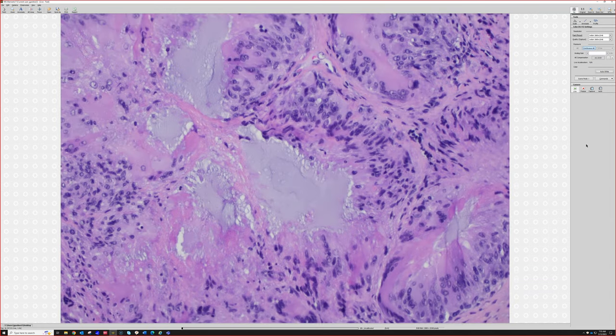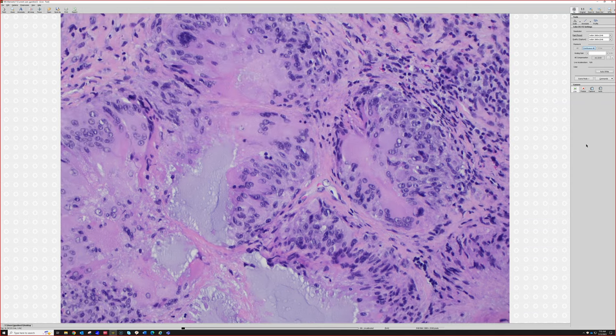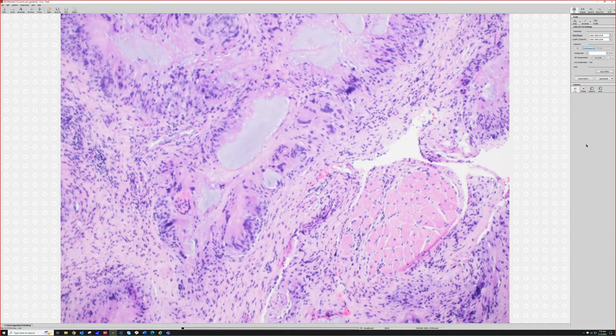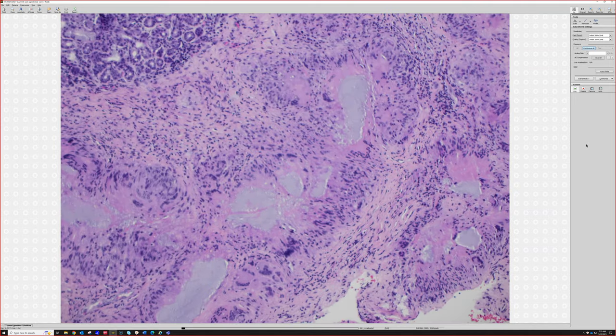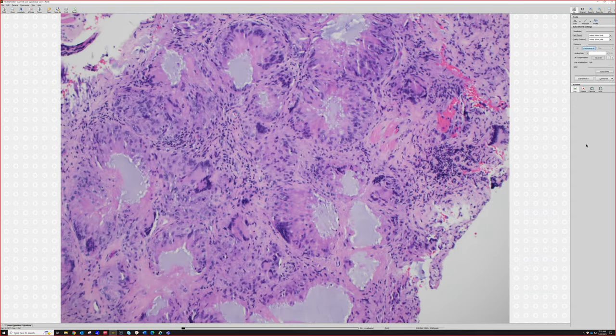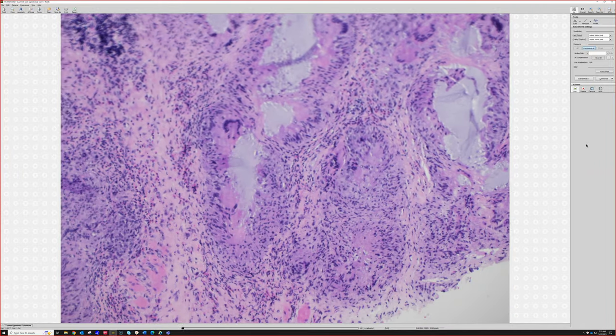And then in the middle, in a lot of infectious granulomas, we'll see pink necrosis in the middle, but we don't have pink stuff. We have blue stuff here. Looks almost gooey, like mucin. Why would we have tons of little mucin-filled areas surrounded by granuloma? Or is it not mucin? Is it something else? Is it filler? It is filler, in fact.